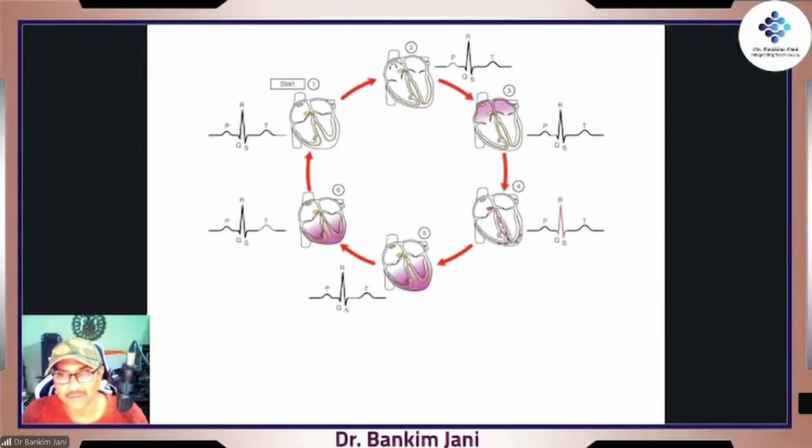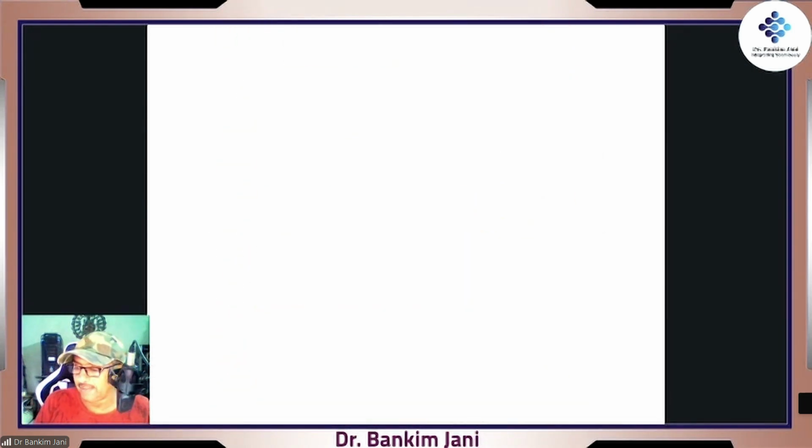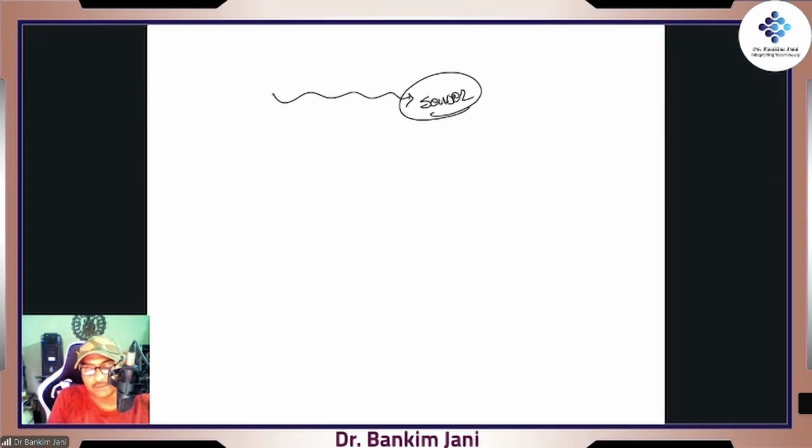Here is a complete cardiac cycle. Now here we just utilize this space for one concept, and all other questions later. So here is our sensor. This sensor is just understanding the pulse, the current, if it is coming towards it. So here it is coming towards it.